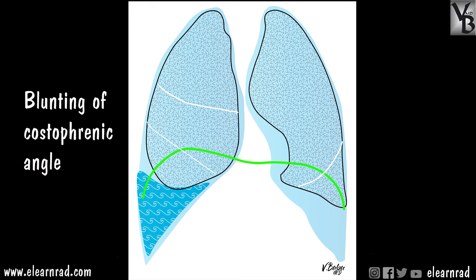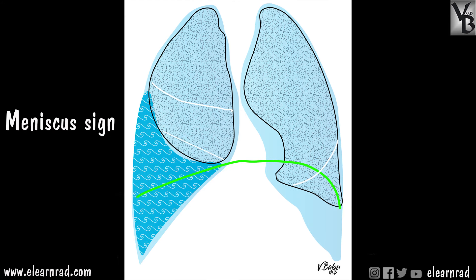Between 200 to 500 ml, the first sign of fluid appears on an erect frontal chest x-ray, which is the blunting of the costal phrenic angle. As more fluid accumulates, the superior margin of the opacity appears concave towards the lung, higher laterally than medially — this is called the meniscus sign. Above and medial to the meniscus, the lung will appear hazy due to fluid anterior and posterior to the lung.